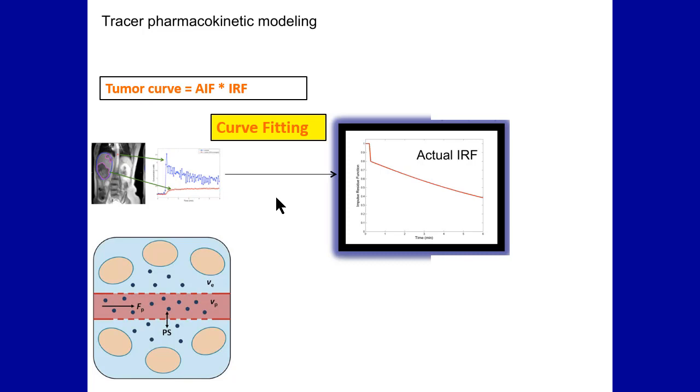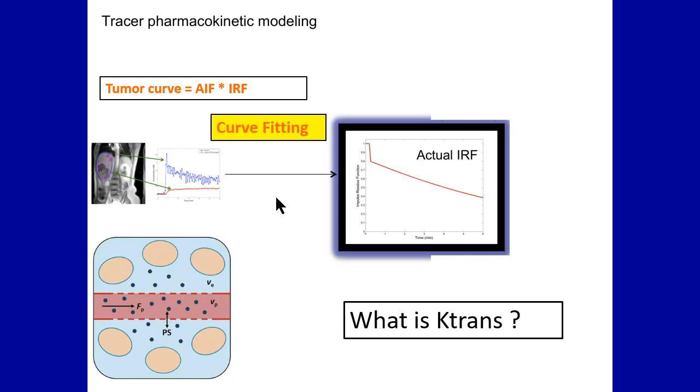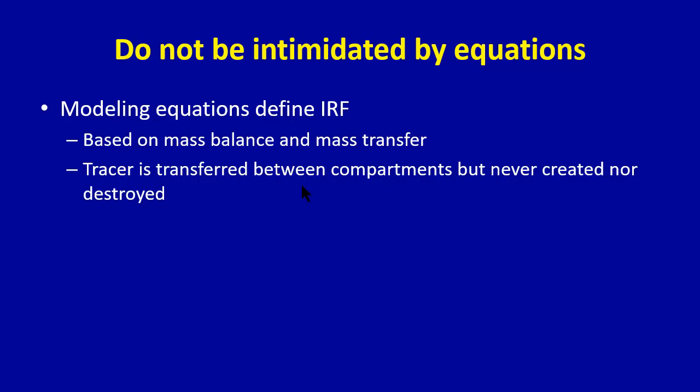So I'm sure some of you might be thinking, well, Dr. Thng, that's great, but you haven't explained to me what is Ktrans. I keep reading about Ktrans all the time. Okay, what is Ktrans? In order for me to explain Ktrans to you, I need to take you through the equations, because Ktrans is a simplification of the modeling equation. So if you please bear with me, do not be intimidated by equations.